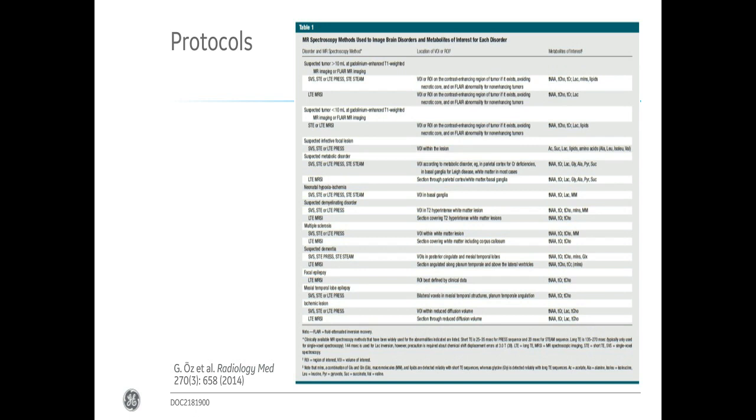This is really a very, very good reference for everybody doing clinical spectroscopy, with recommendations where spectroscopy has shown and proven usefulness and where it might help. It really lists a lot of application areas, together with how the protocol should look.